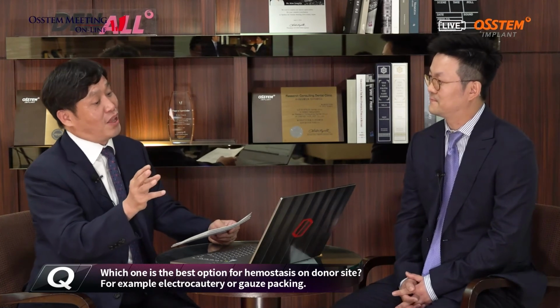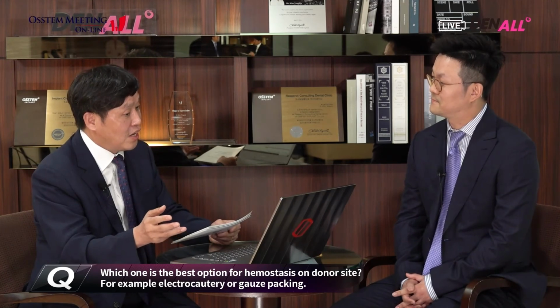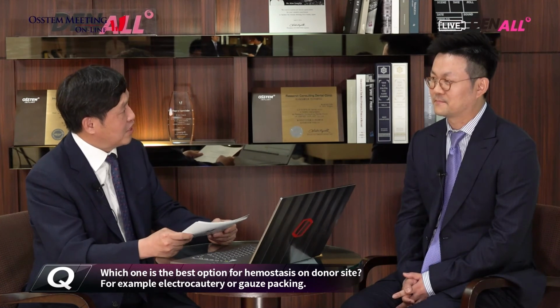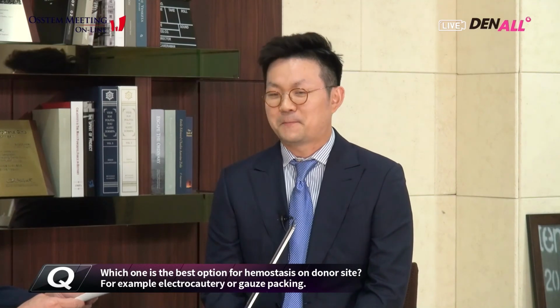The second question is, which one is the best option for hemostasis on the donor site? There are some methods of hemostasis, such as electrocautery or gauze packing. What is the best option for donor site hemostasis? I think the best option is the surgical wafer. It's very easy and simple, and with the surgical template we can save time. The second choice can be Surgicel.